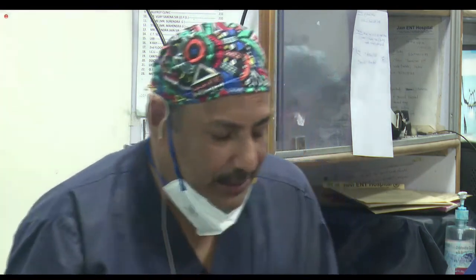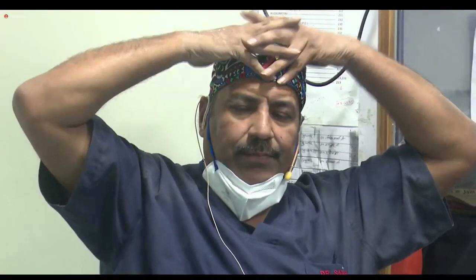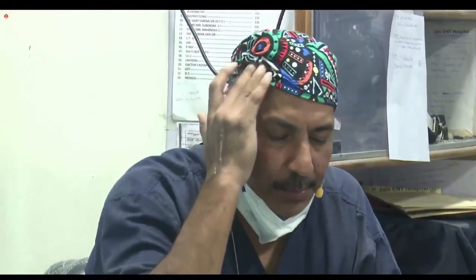See, the idea is you don't miss any important structure. The finer the section, the picture will be less clear. Secondly, with 0.625, you don't miss any structure. The most important structure is the anterior ethmoidal artery, which is roughly 0.8 to 0.9 millimeter in thickness.